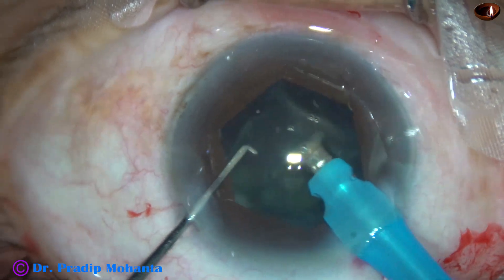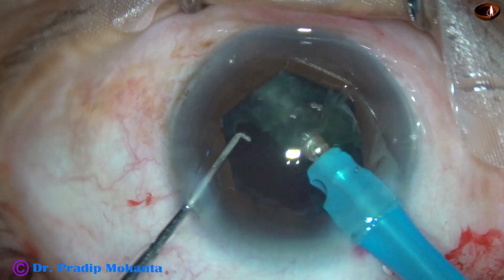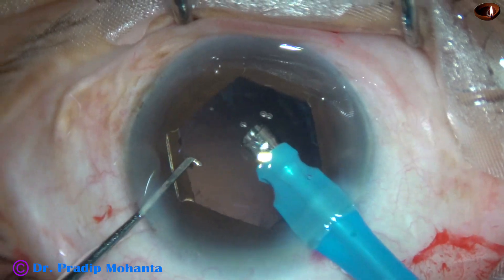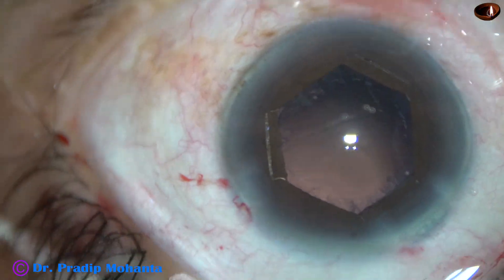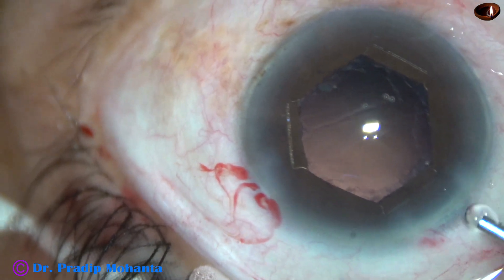Followability is much better with this SPEEP mode and the anterior chamber stability is much better with the SPEEP mode. Now, this is the last nuclear fragment — it has been managed. This is a chunk of epinucleus. Yes, it is done. The nucleus has been nicely managed.